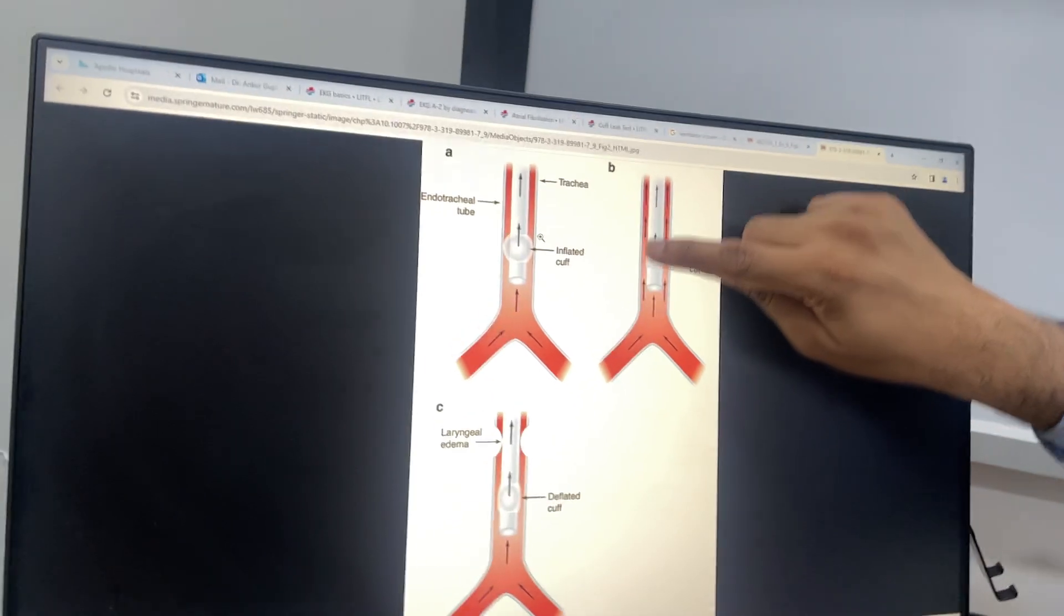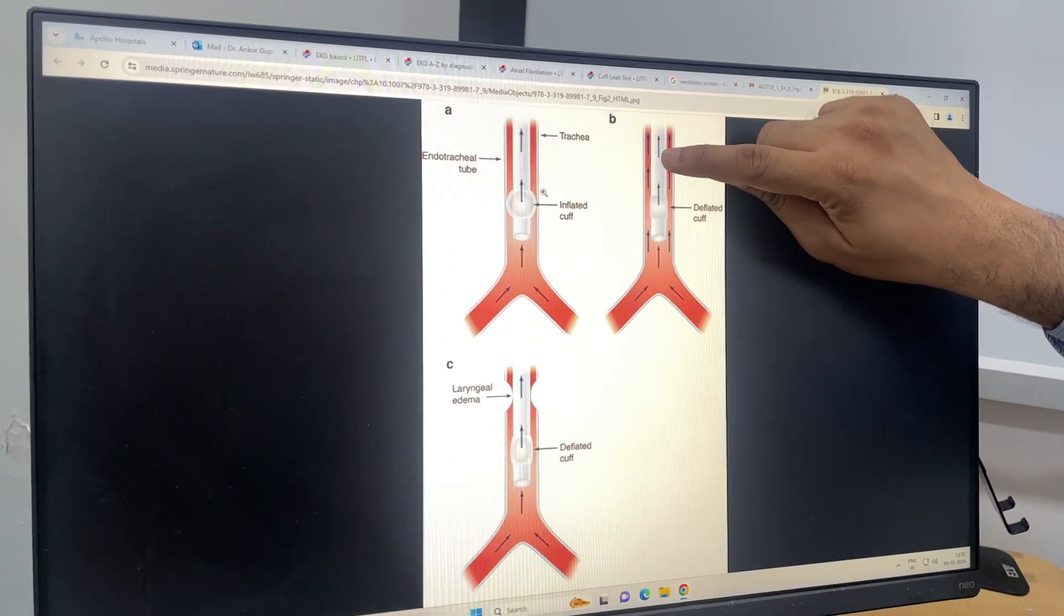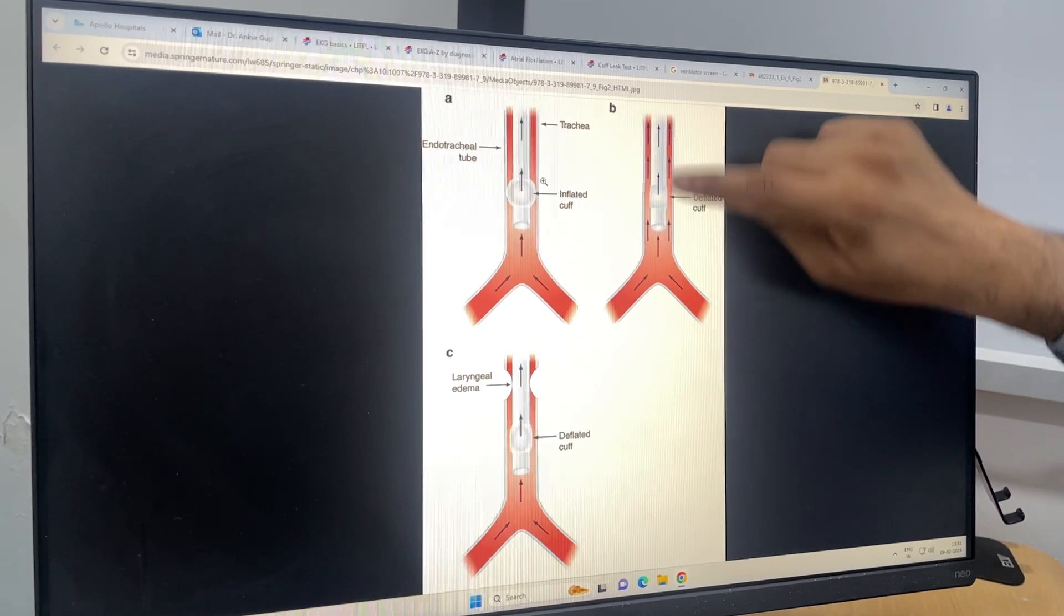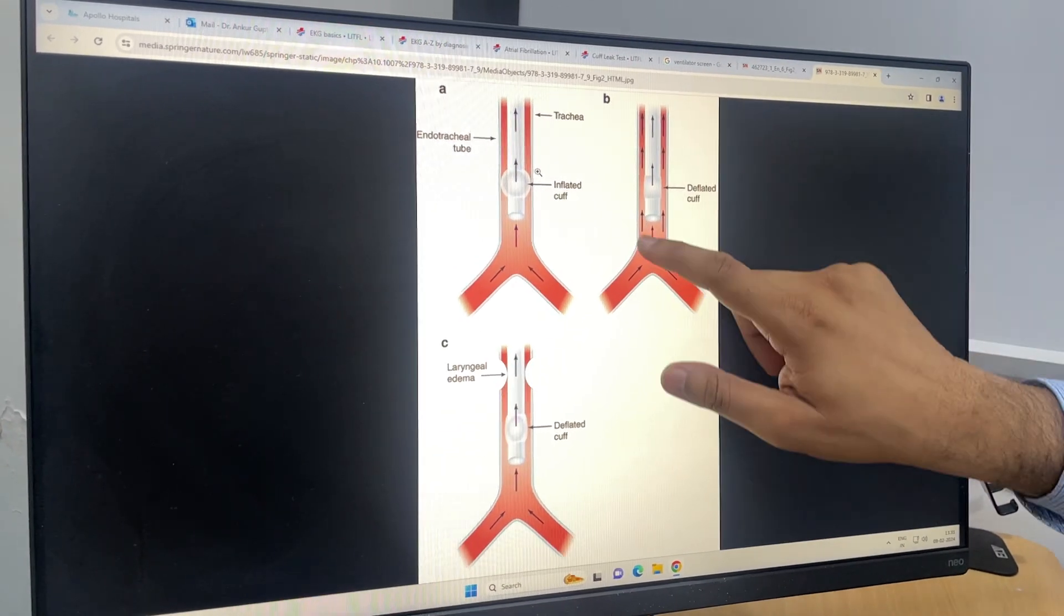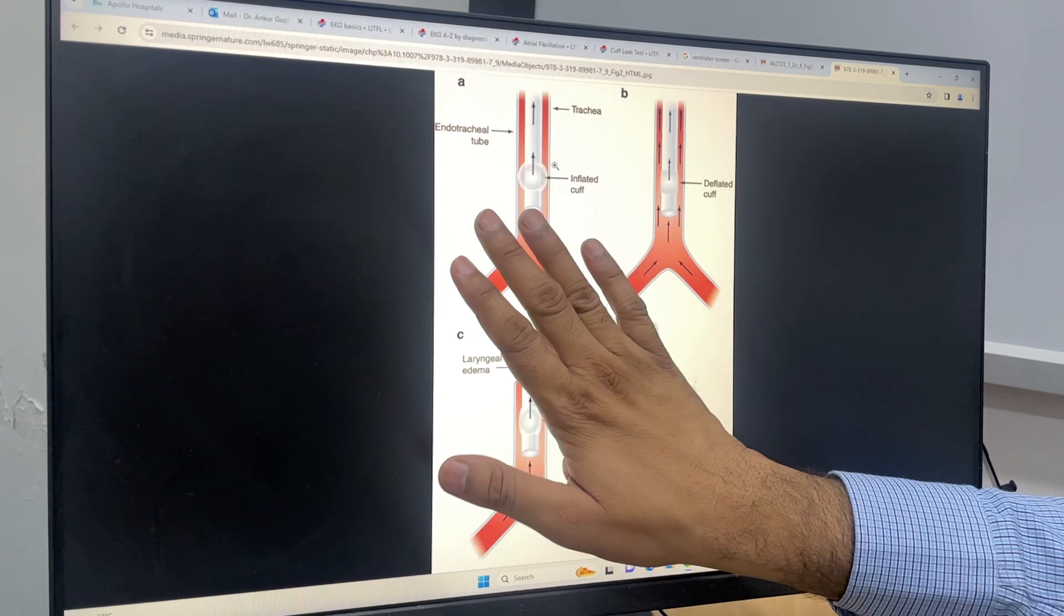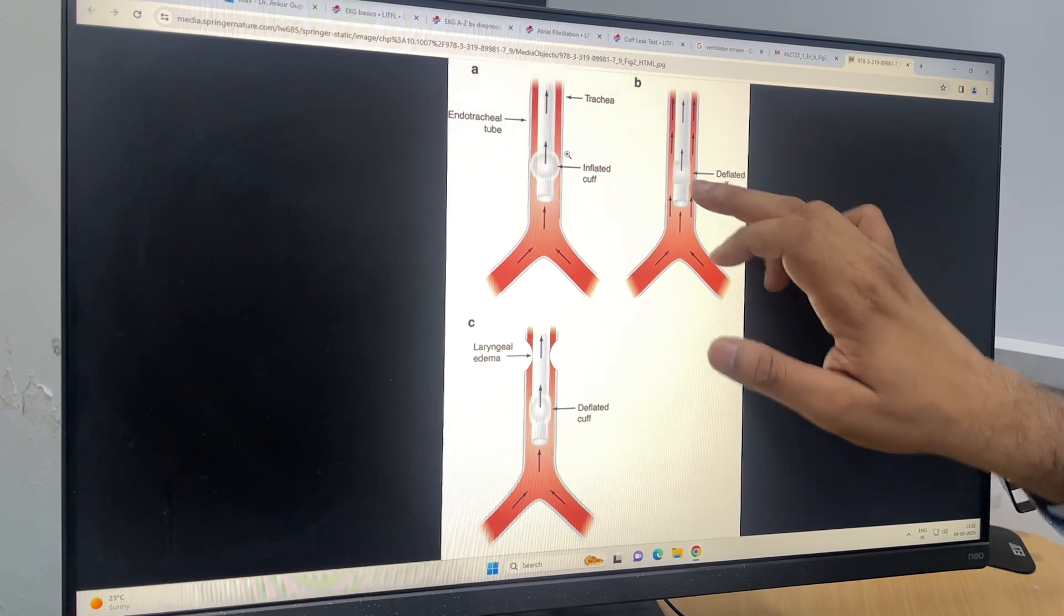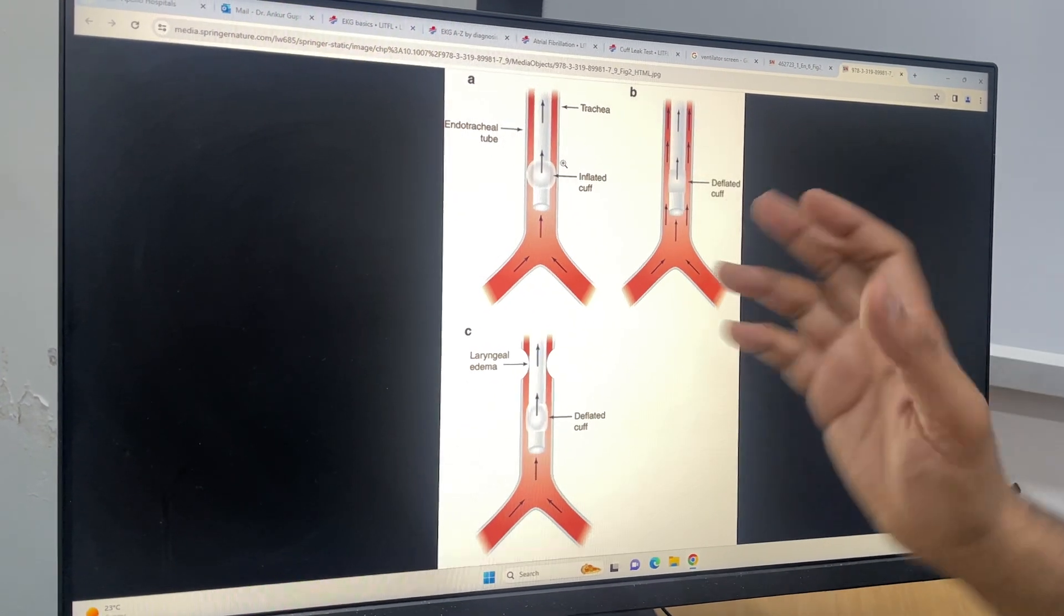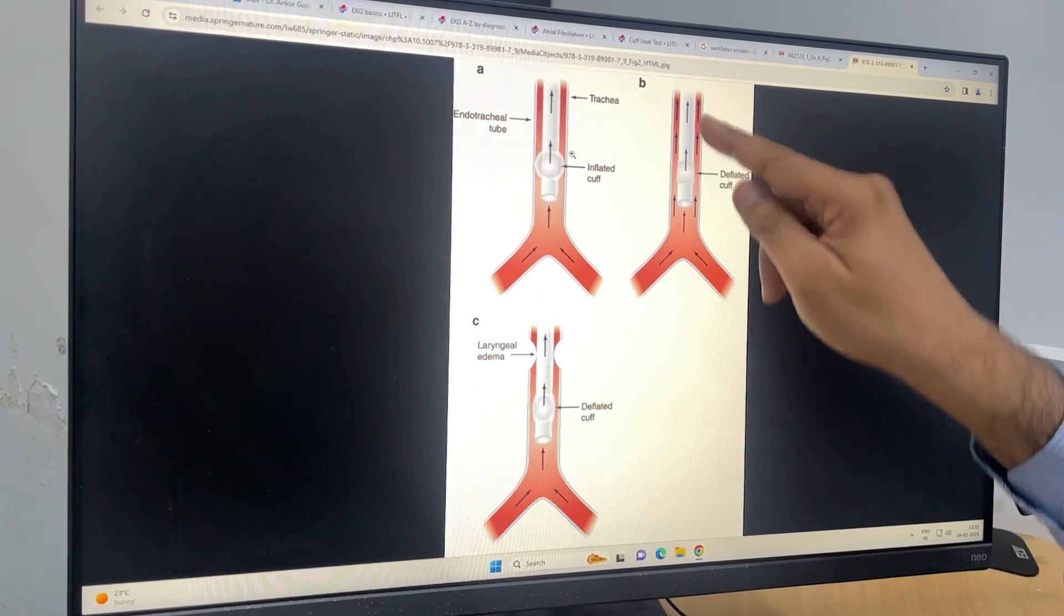Now when you deflate this cuff, what should happen? Whatever expiratory volume is going there, along with getting exited through this endotracheal lumen, it should always leak through the side walls of the endotracheal tube. So your ventilator will sense that it has not received the full expiratory tidal volume. Suppose you have a tidal volume set of 500—when you deflate the cuff, because the expiratory tidal volume air has leaked, the expiratory limb will detect only 300 or 350 because that air has leaked.